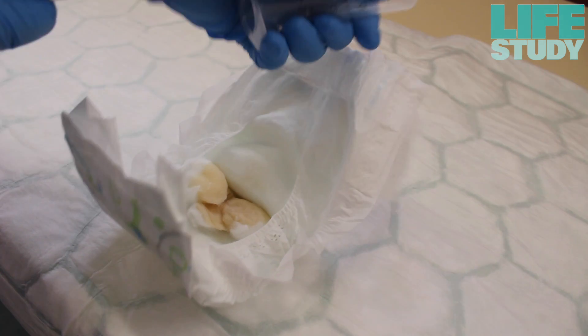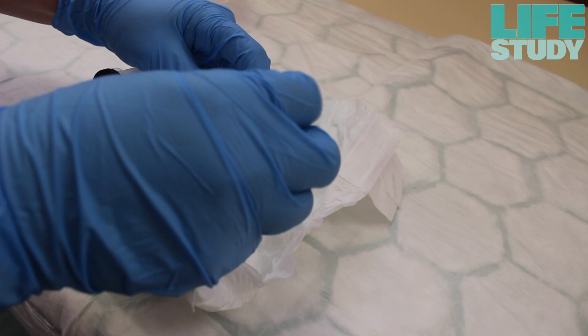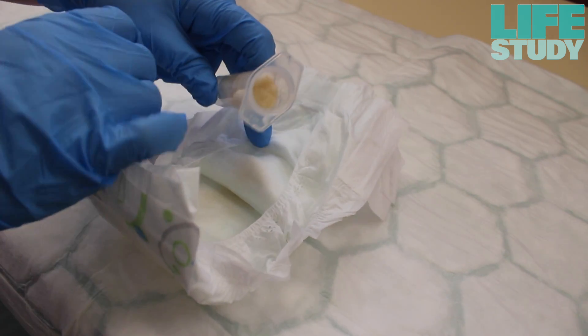To extract the urine from the cotton wool balls, remove the plunger from the 20ml syringe. Wearing gloves, place the cotton wool balls containing the urine into the syringe and then replace the plunger back into the syringe.